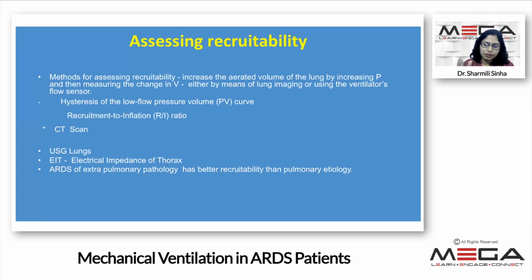By default, when you're setting the ventilator for low tidal volume or lung protective ventilation, we start as per the recommendations. You keep a moderately high PEEP, around 8 to 10, for all these patients and see the response. If a patient is responding to that amount of higher PEEP, you can try slowly increasing the PEEP further, as if your FiO2 requirement is increasing, and see the response.